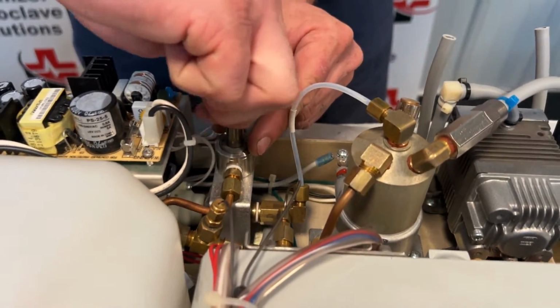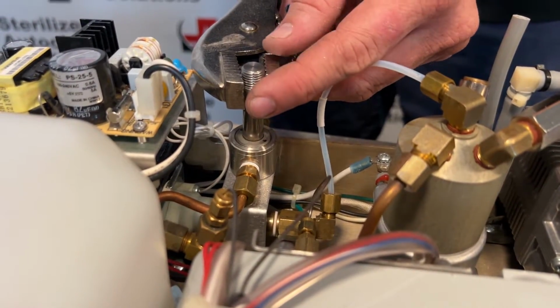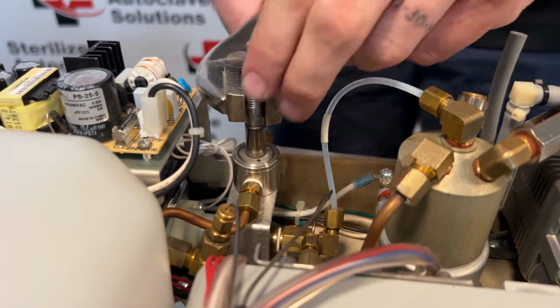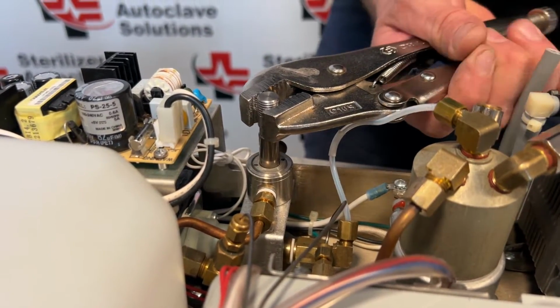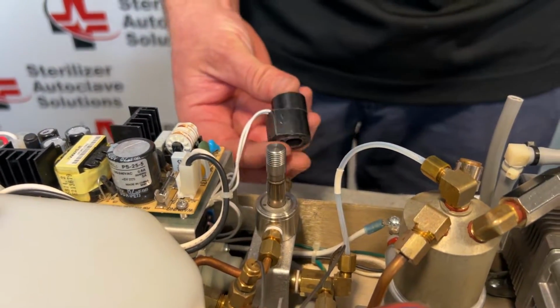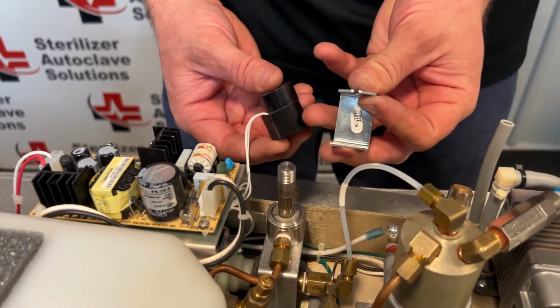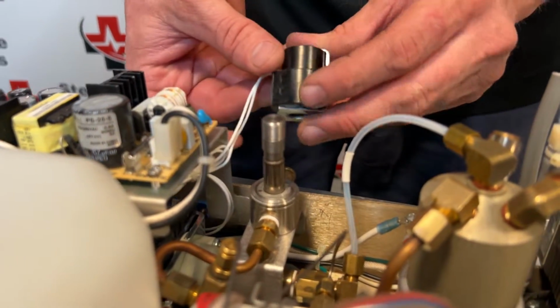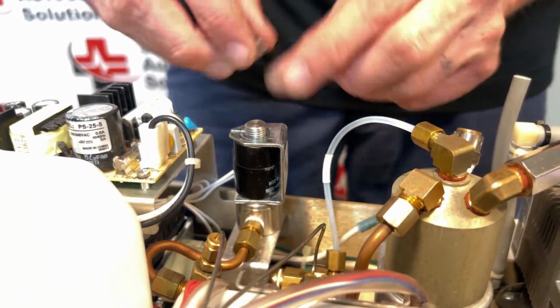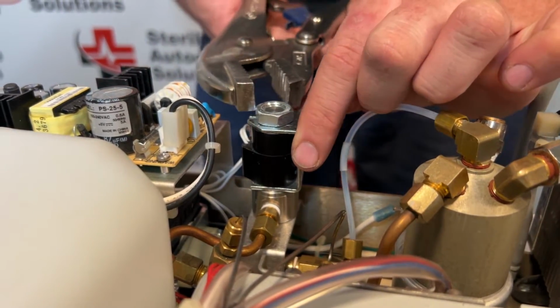When tightening this down, you don't need to go really tight. I'm going to use the same pliers, grab above the hollow part. Once that's in there, with the wires facing up and the hollow part of that C-channel facing up, slide that together, push that back over the stem, and tighten that back down.